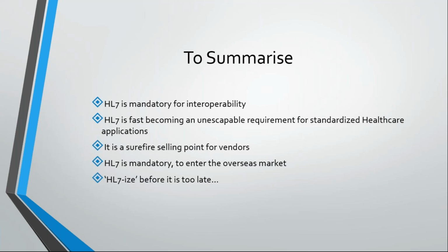FHIR is just an enhanced version of HL7, you can say. All the data elements that you see in each HL7 segment are basically converted into a resource, to put it in a very simple way. So you will be able to learn FHIR as well once you learn HL7. That concludes today's session here. We will see more on it tomorrow. Any questions from anyone?